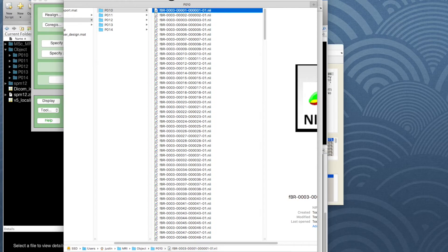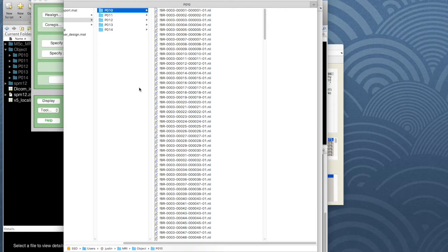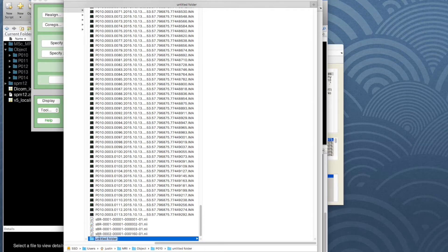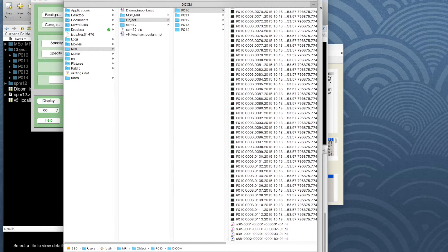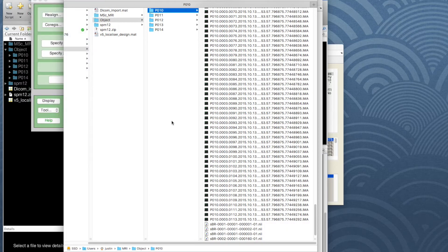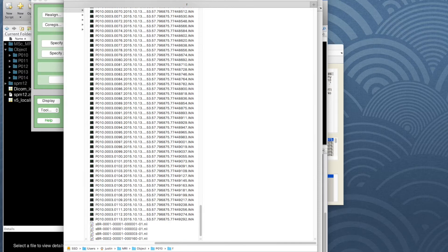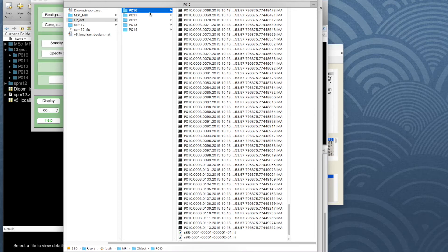What I'm going to do is create some subfolders for the different types of images. On Mac you can use Finder, on Windows you can use Explorer, but it's actually quicker to use a terminal or write a script in MATLAB. For simplicity I'll create subfolders here for participant 10. I'll create a folder called Dicom and put all the DICOM images in there. I'll also create a folder for functional images — I'll just call it F. So we've got one for Dicom and one for the functionals.